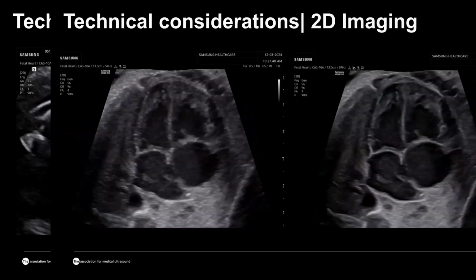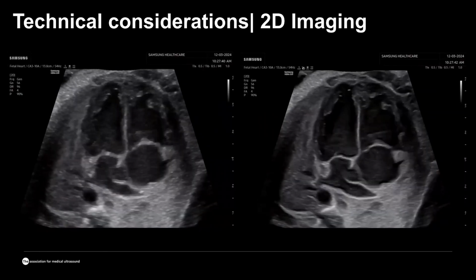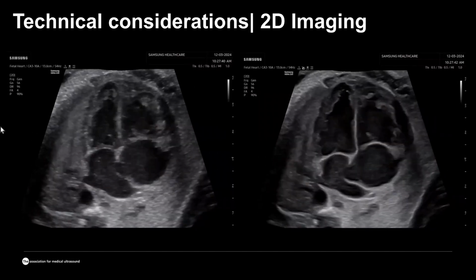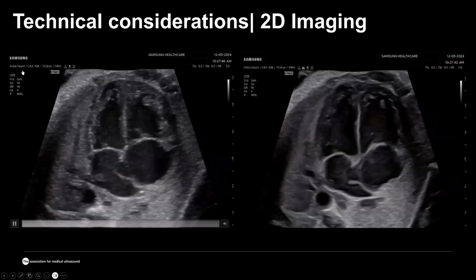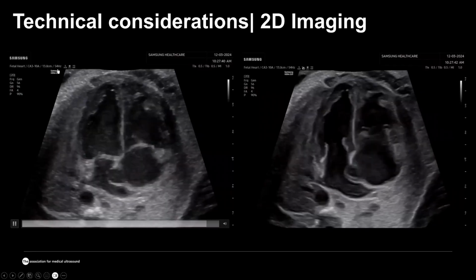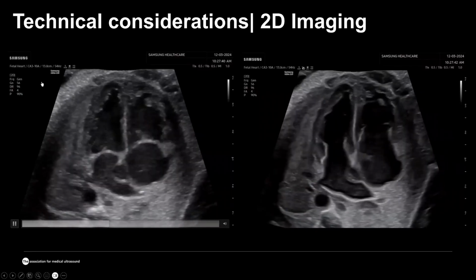But what about the other controls and the other tools that we have to improve the image and the visualization of the cardiac structures? Here there is the same picture, and you can see if you read these controls over there. This is taken using the same preset, the same probe, the same depth, the same frame rate, and all the other parameters of the 2D imaging.